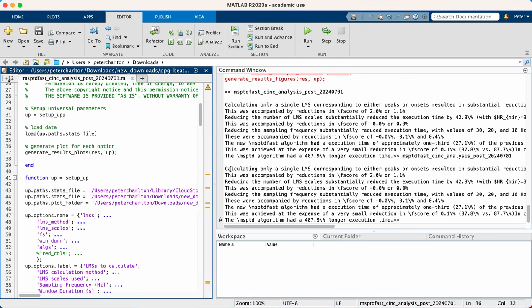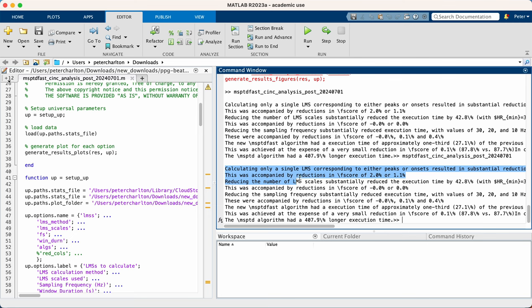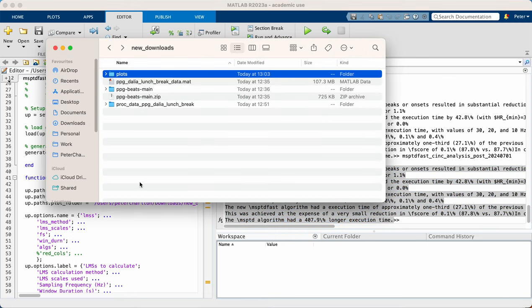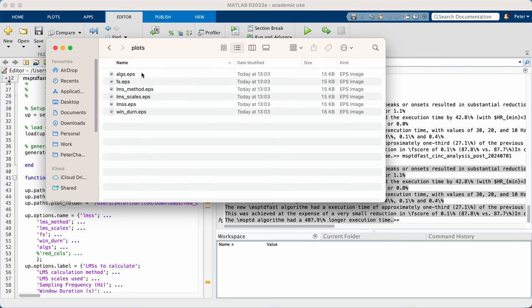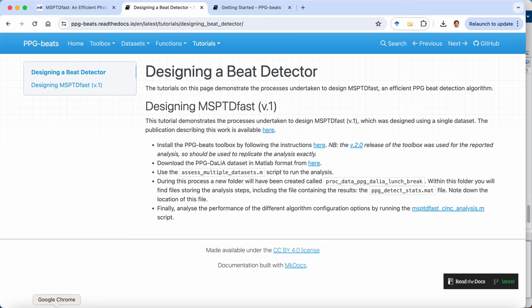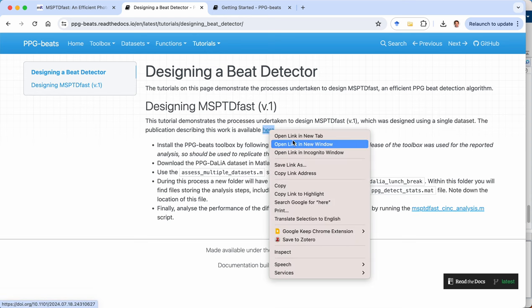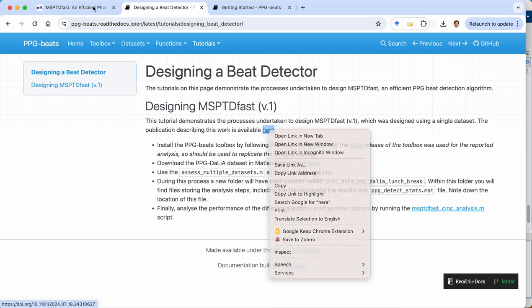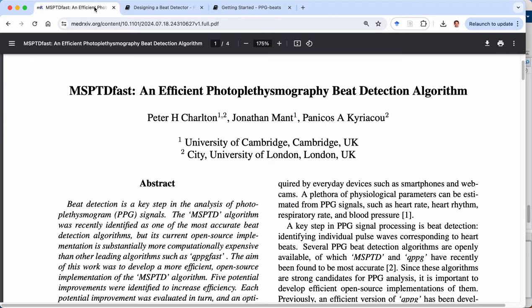So that's finished. You can see there are some details outputted here, which we'll come back to. But first, let's take a look at these plots. So here we have various plots and these correspond to the plots in the publication describing this work, which I've already opened here.